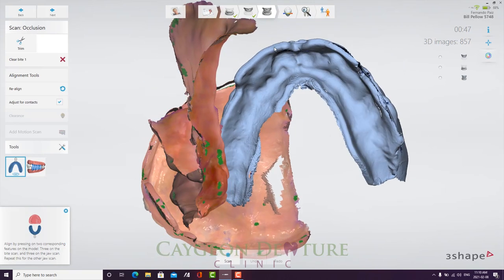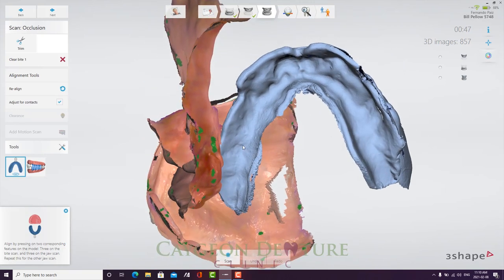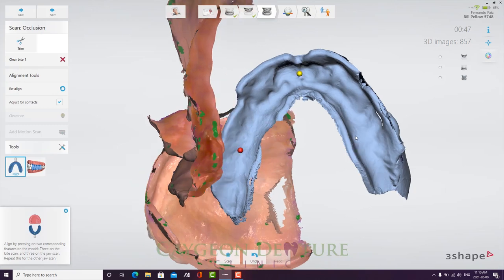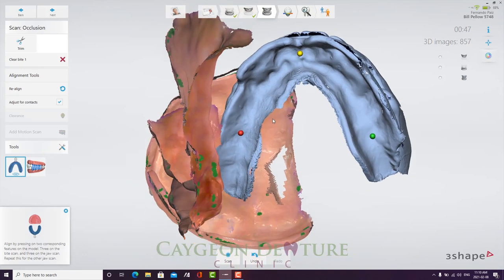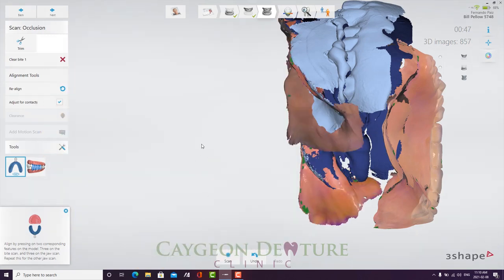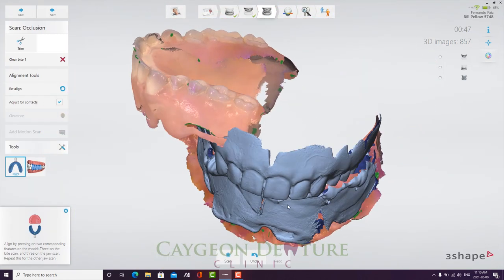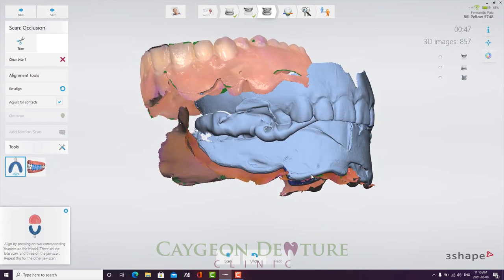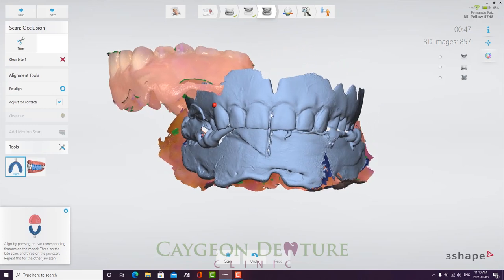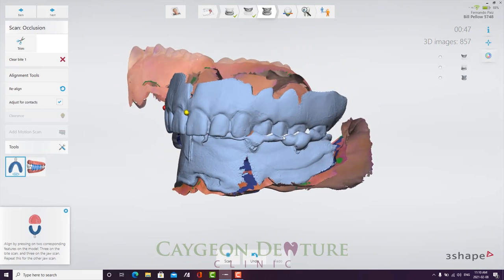Once the bite has been scanned, then I go ahead and use 3 points of reference on the bite rim, and do the same thing on the edentulous scan, and I let the software automatically do its job. I do also the same thing with the complete upper denture. I do 3 points on the bite scan, and then 3 points on the actual denture in order to line everything up.